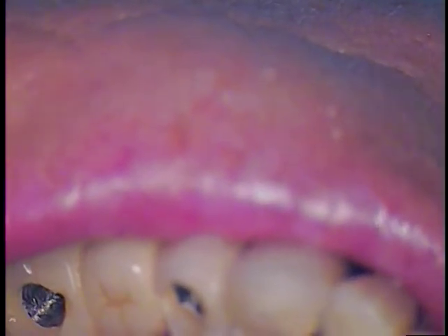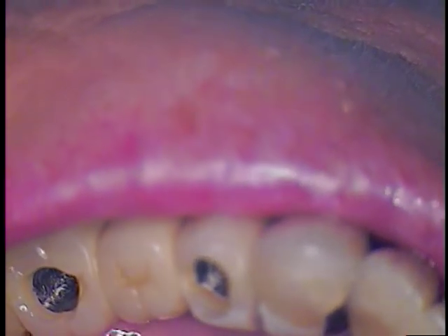This is Dr. Jerry Cuomo. I'm back here with this rescue case. It is a combination Brandenmark as well as Zimmer. We were able to finally — here we are three hours later. This is really almost a labor of love with this case.